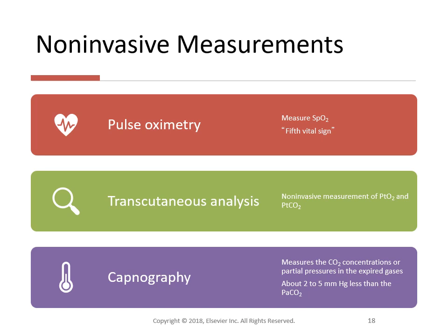Periodically, an increased amount of light is absorbed due to an arterial pulse. This yields variable rates of absorption for oxygenated hemoglobin and reduced hemoglobin. The oximeter compares these differences in light absorption and computes the SpO2.